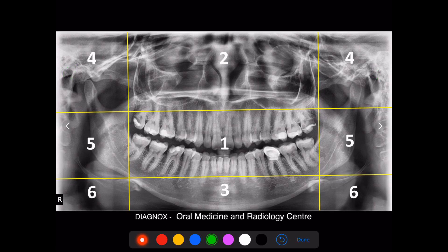In zone 5, you will be able to see the angle of the mandible as well as the ramus region. Whenever you are checking this, always check whether it appears symmetrical bilaterally and always see whether the inferior alveolar canal appears normal on both sides. This is also the area where sometimes you will be able to see elongation of the styloid process or calcification of tonsillolith, parotid duct, or parotid glandular calcification.